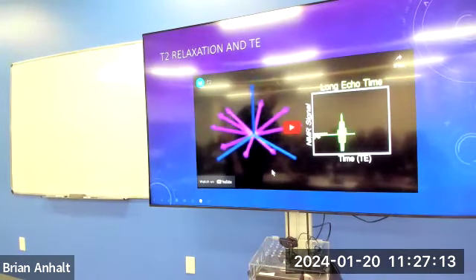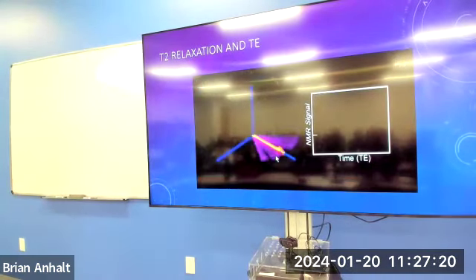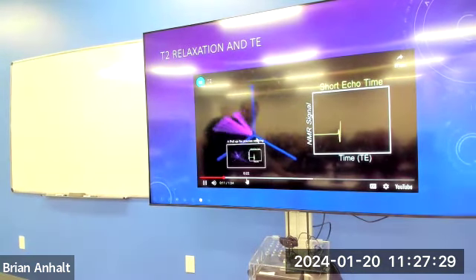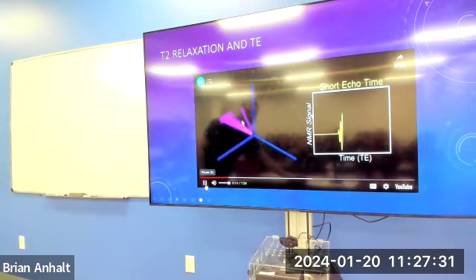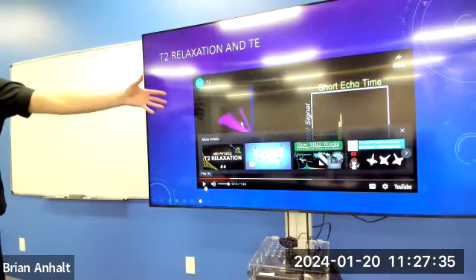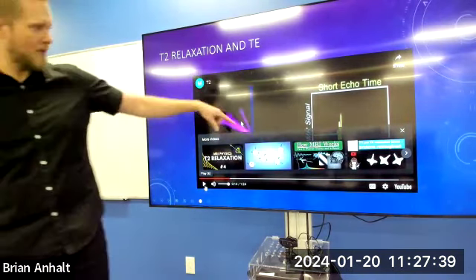So here we go. One last video. Excited, they get out of phase, signal diminishes. If we were to measure it, we flip them over. And if we look at what happens with short echo time, they're almost perfectly in phase. This is just going to show one tissue, but it's showing with one tissue at a longer TE what's happening, right? So this was a short TE.